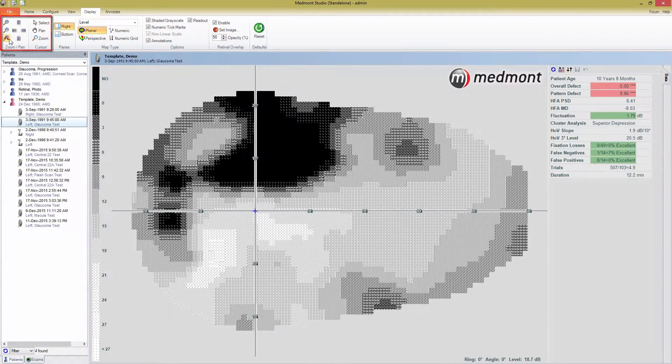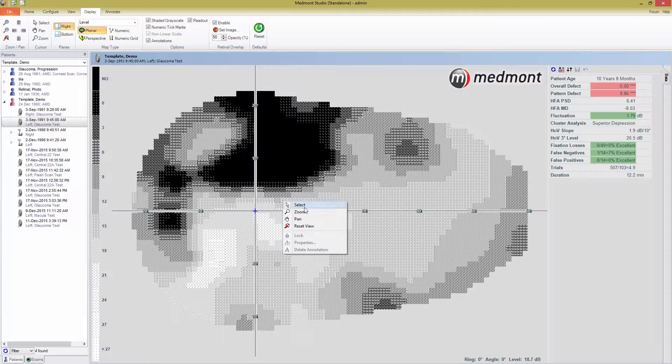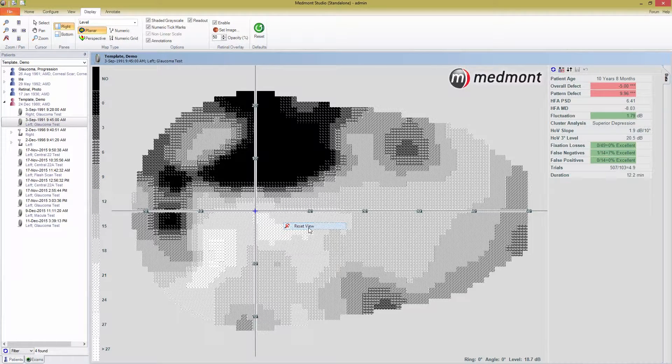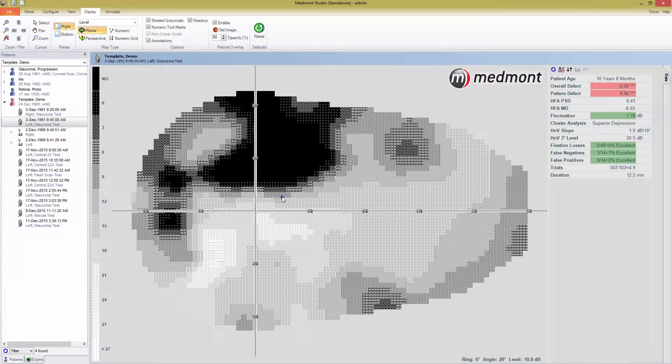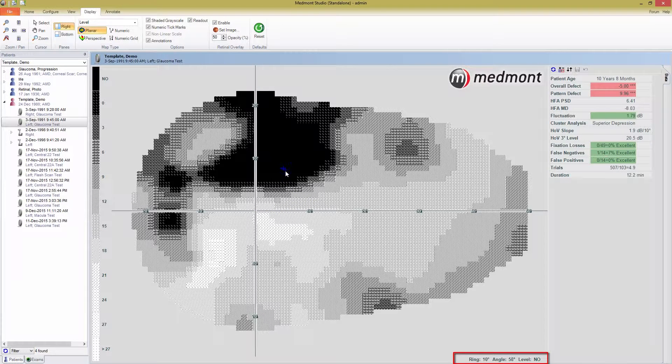If you do move the map around, pressing the right mouse button gives you the option to change cursor types and reset the view to the default. Clicking a spot on the map displays the associated field data in the bottom right, the location on the field, and the threshold in decibels at that location.